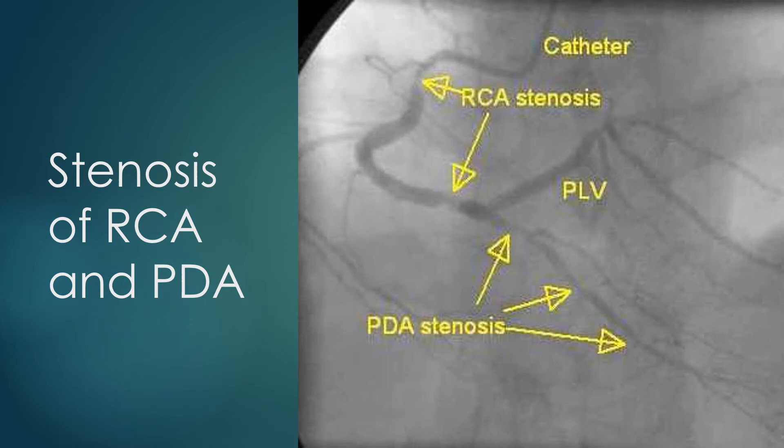The PDA shows three tandem stenoses from the proximal to distal region. The PDA appears to be a smaller caliber vessel than the PLV. This could also be because the vessel is underfilled due to the tandem stenosis. Very often, the vessel size increases remarkably after opening up the lesions by balloon angioplasty or stenting.